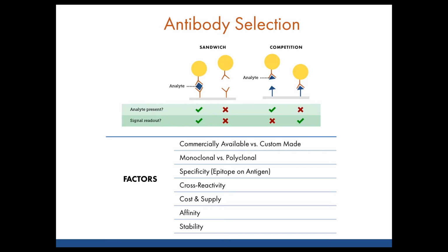Overall, the antibodies need to be screened empirically in the lateral flow format. Even if there was a pair that worked best in an ELISA, that doesn't necessarily mean that they will be the best pair for lateral flow. Although the assays are similar in theory, the lateral flow assay relies on the antibodies to bind quickly and efficiently to the analyte with an extremely short contact time in comparison to an ELISA.